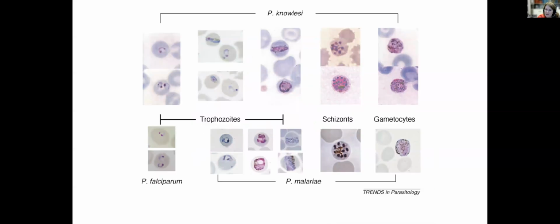And then you can see the stippling. And then the trophozoite inside is a little hard to appreciate, but often it's more compact than Plasmodium vivax. Sometimes we can't tell them apart, and then we just say Plasmodium vivax/ovale, since the treatment is very similar for the two.